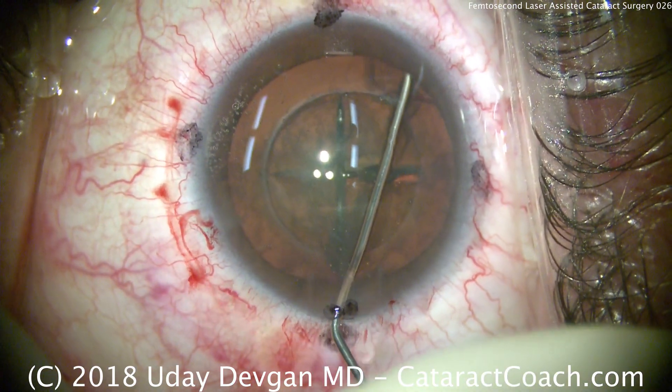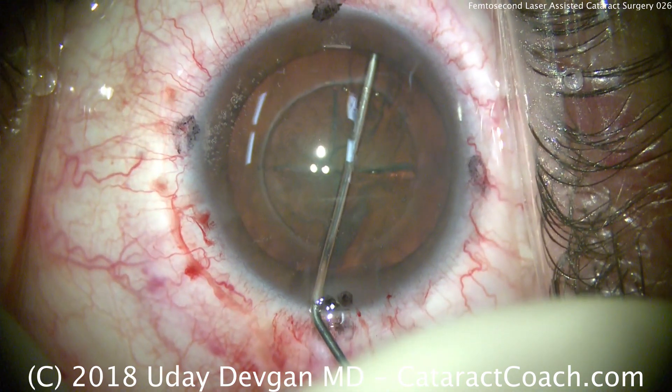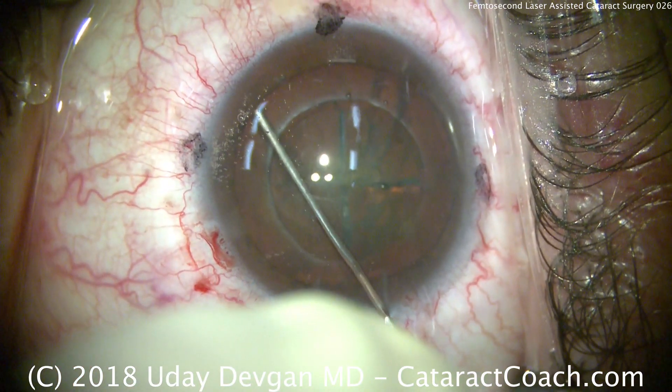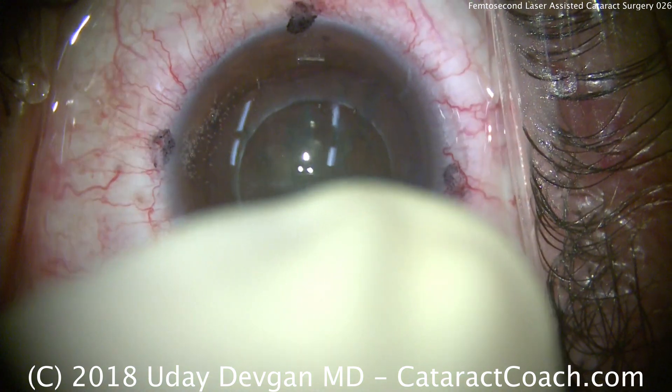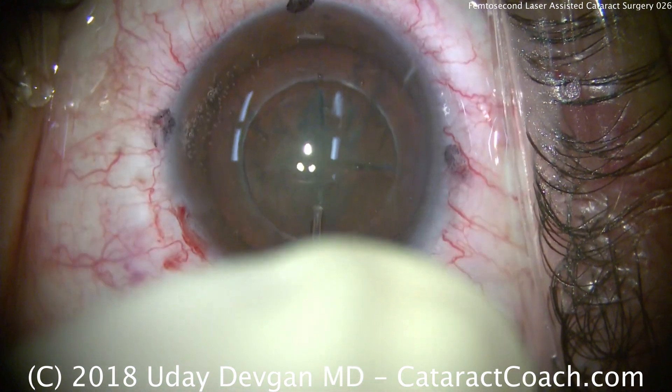This is not too dense of a cataract; the lens should split quite easily and should be easy to emulsify. We need to be careful not to prolapse the nucleus out of the capsular bag — the edge of the capsulotomy created by the femtosecond laser may not be quite as strong as one created manually.